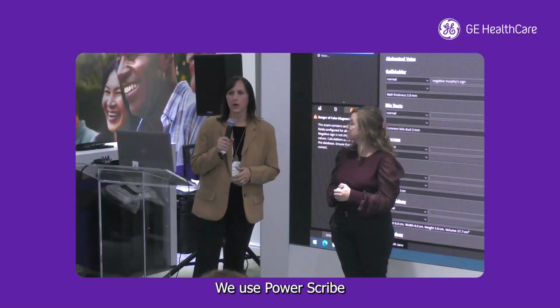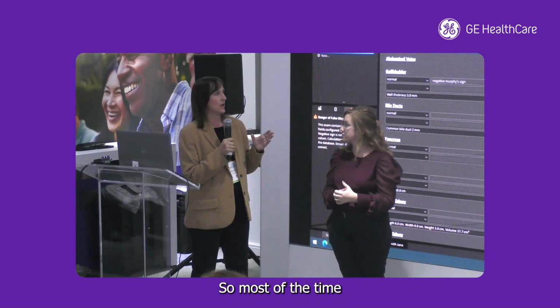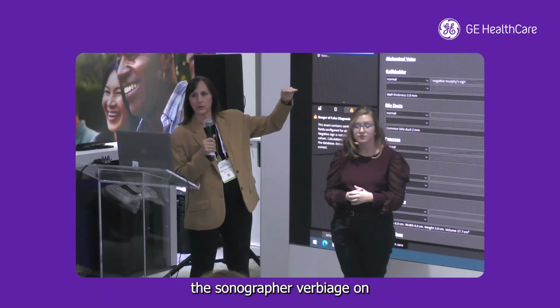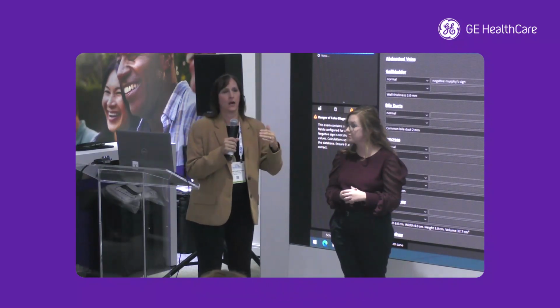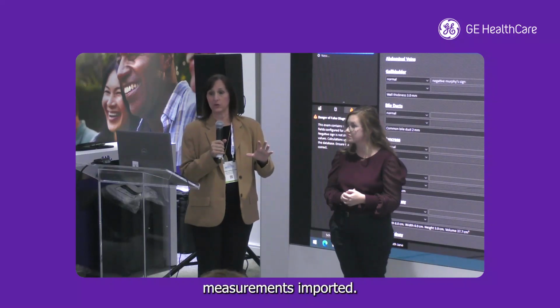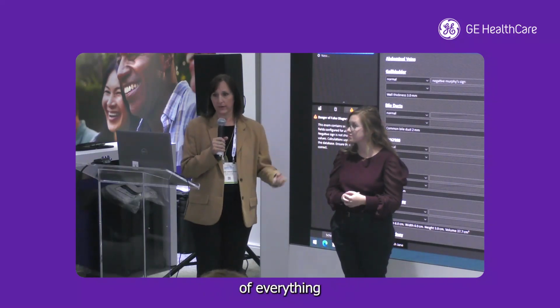Yeah, we use PowerScribe, and we have very intensive templates. So most of the time, I don't feel the need to have the sonographer's verbiage on like liver texture or fatty liver and all those things. I don't generally need those to come into our templates. But the radiologists, we're huge on the buy-in on having all those measurements imported. So now I'm not having to constantly dictate every size of everything into our template.